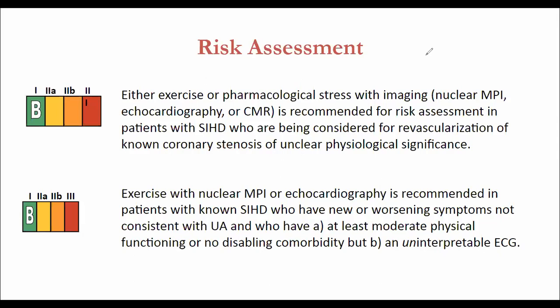If we have a large size perfusion defect of high intensity at rest, and we don't want our patient to exert because of the defect at rest, how will it be known whether it is reversible or not? But if there is already a defect at rest, what you want to know is viability. Then you have to give nitrates to the patient. In that case, you don't have to give any stress to the patient.